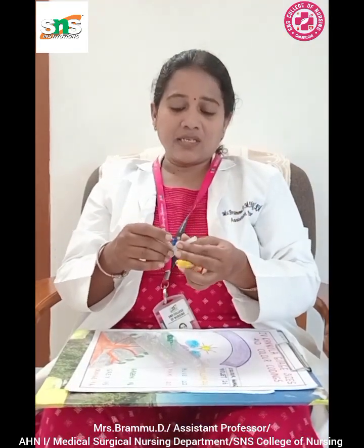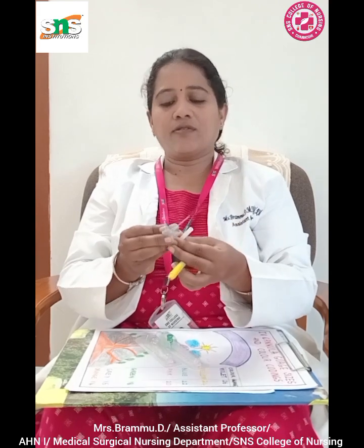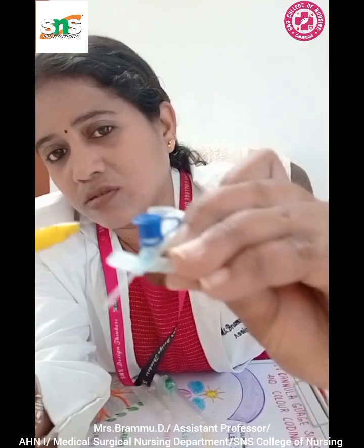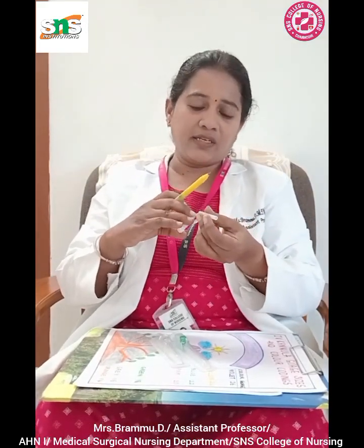So the next, which we can see in depth, is the valve. So this is the valve. I'll come closer. So you can see the valve over here. Yes, this is the valve. Positioned with the cannula, the valve regulates the flow of fluids, preventing backflow, maintaining a controlled administration during the medications.